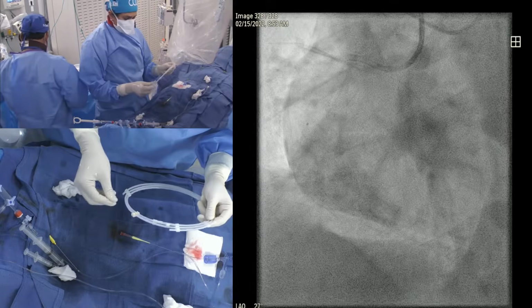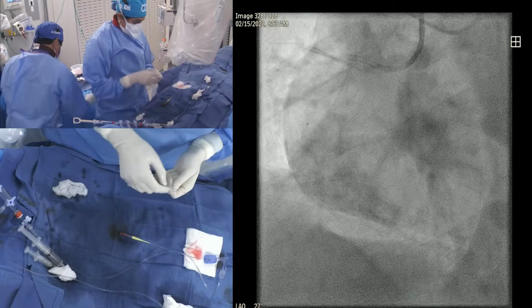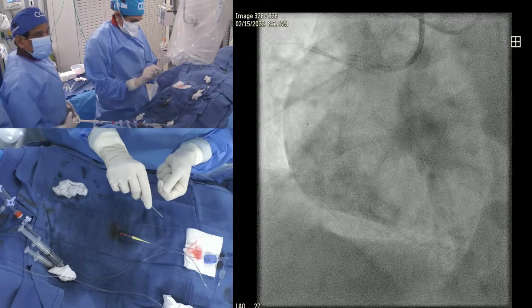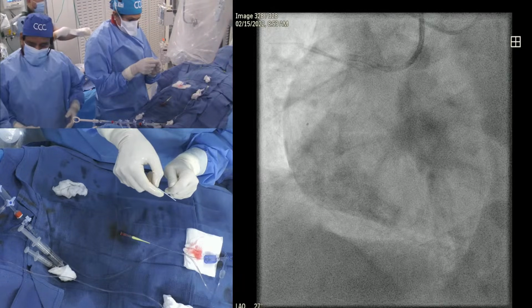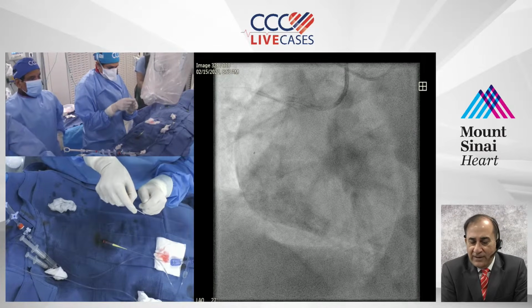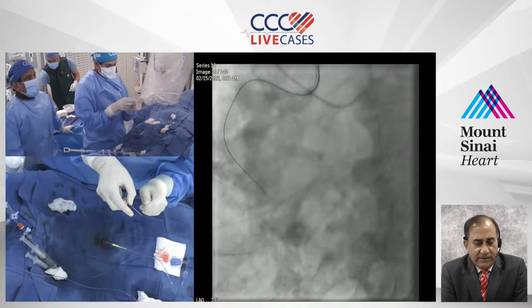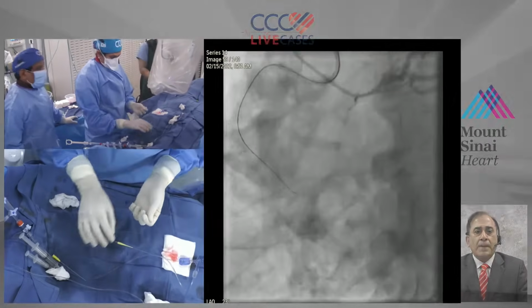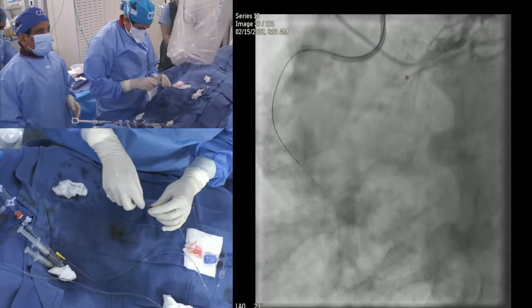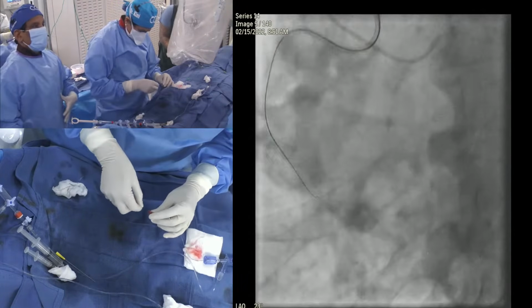I need a VL guide quickly. A very fine observation by Farzad Shanshai, who said that antegrade injection must be very gentle, otherwise it's going to extend the coronary dissection. A very good point, Farzad, noted and disseminated. Clearly try not to give a pressure injection, and just do a very soft 1 cc injection, as you can see here. Remarkable observation, exactly what you have demonstrated there.